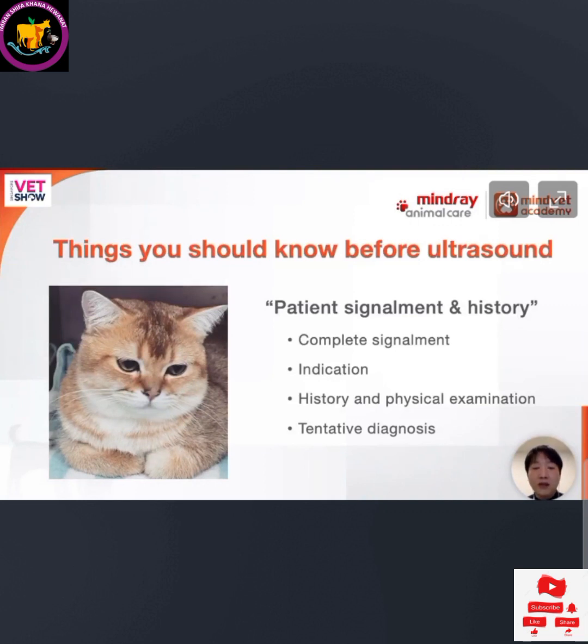The patient history and indication for ultrasound can guide the focus of the examination. Symptom duration of the issue and previous treatment can help identify the specific area of concern, improving the efficiency and accuracy of the examination. Finally, a list of differential diagnoses can help direct attention to specific conditions based on the reason for the ultrasound examination.